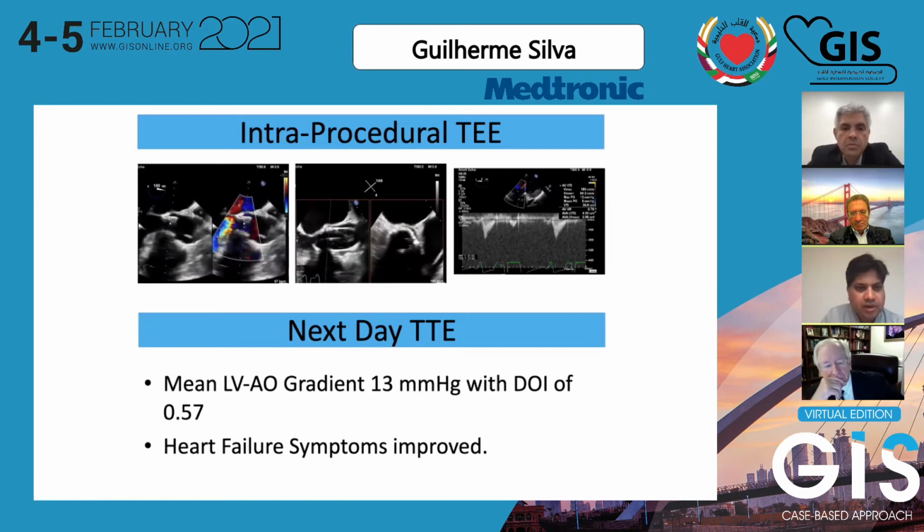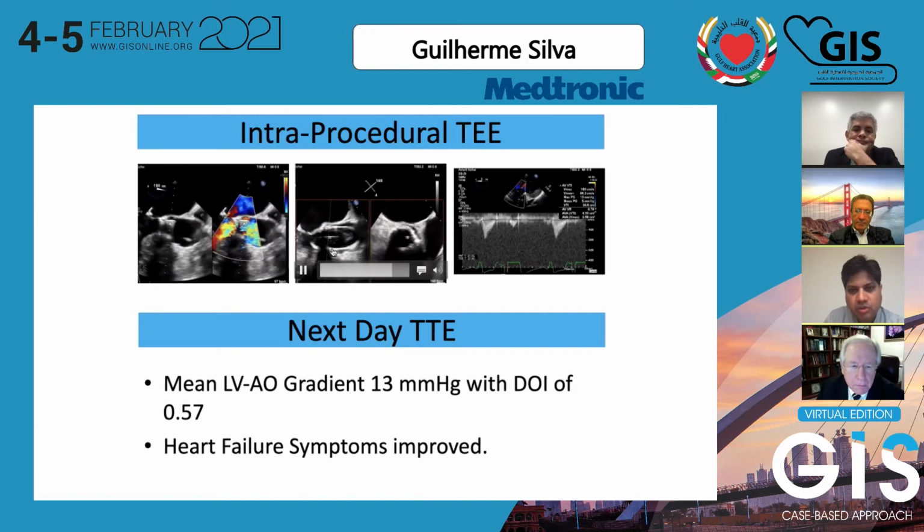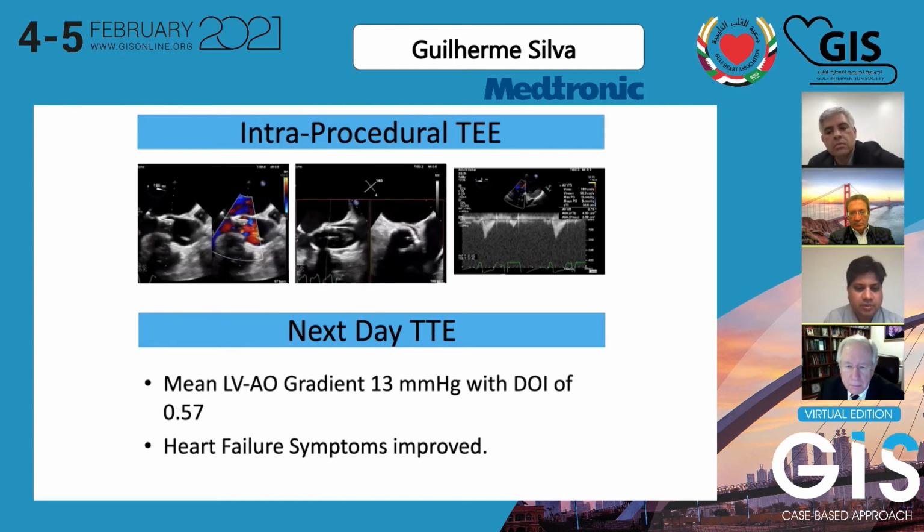One can see clearly the valve is still adherent to the ring, but it's not expanded as well as what we expected. This is the balloon. You can see how much it's really expanded out, making these stent struts move out of the post, showing that this is stretched and cracked. And finally, you can see the dimensionless index, and the mean gradient is 5. So this is a very well done case, and good work, everyone.